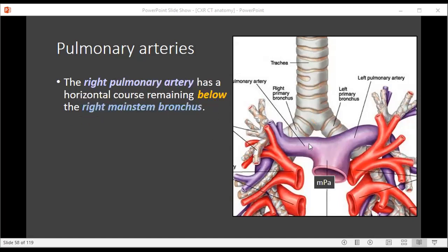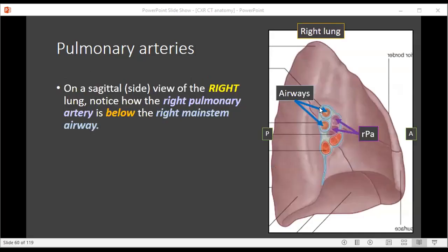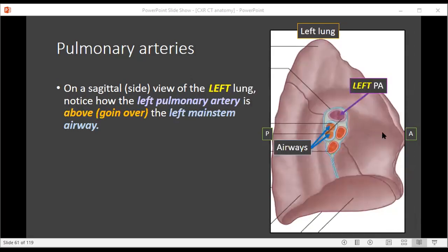The pulmonary arteries have different courses with respect to the main stem bronchi on both sides. The right pulmonary artery remains below the right main stem bronchus. The left pulmonary artery, on the other hand, goes up and over and eventually behind the left main stem bronchus. As a result, the left pulmonary artery is higher in location than the right pulmonary artery. This can also be seen on sagittal views: the right pulmonary arteries sit below the main stem airways — airways above, pulmonary arteries below. On the left side, the pulmonary artery goes up and over the airways — another key relationship to know.